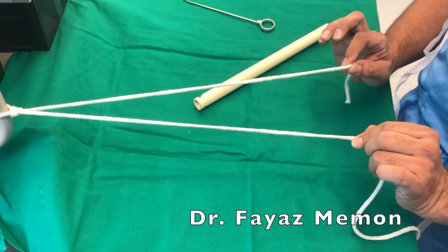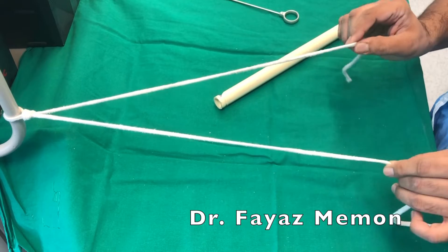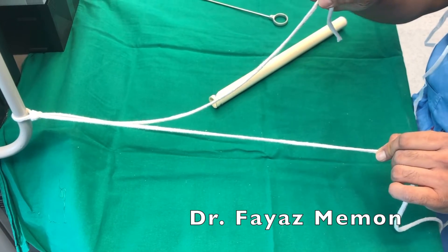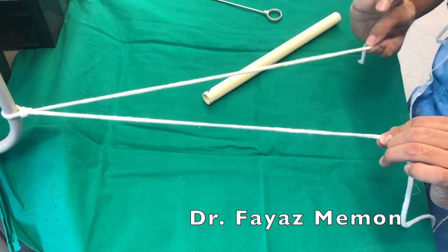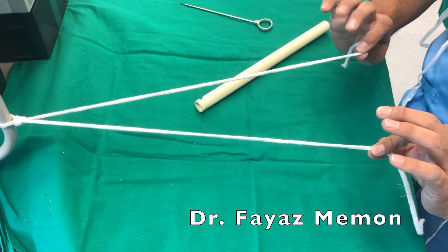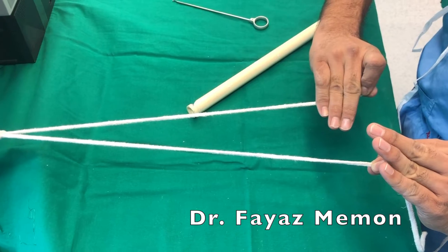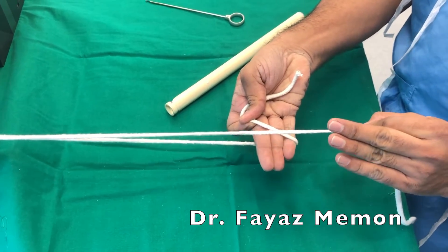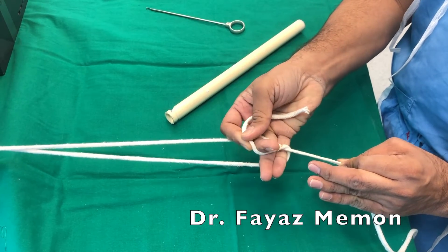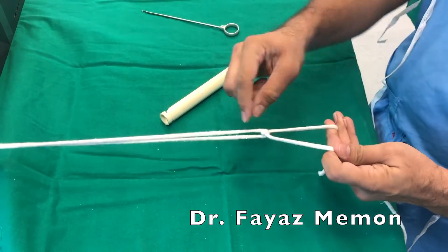Now I am going to teach you a stationary knot. Here is the scenario where there are two suture limbs which cannot slide because there is a knot already tied, so in this situation I cannot have a sliding knot. The other reason you need to know about the stationary knot is that you need to take half hitches to secure the sliding knot. So this is the first suture limb and this is the second suture limb, both of which I am holding between my thumb and index finger. Now I am going to turn my three ulnar fingers over the first post and take a turn like this, then keep the second post over my three fingers, take my middle finger over the first post and take the knot. This knot is going to be pushed by my knot pusher right up to the knot over there.